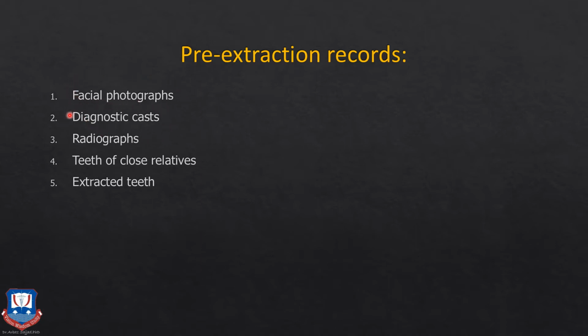If previous diagnostic casts are available, or any radiographs like profile silhouettes or lateral cephalograms, we can view them to get an idea of the type of teeth that we may require or select. So these are just general arbitrary guidelines. There's no concrete scientific proof to it. They can aid us in selecting the anterior teeth if you are in doubt.